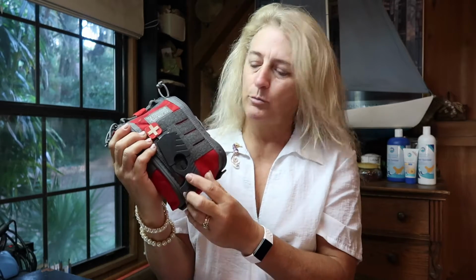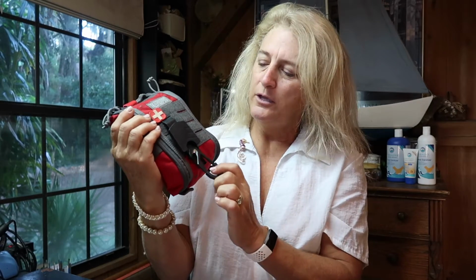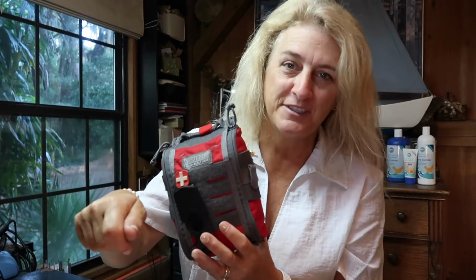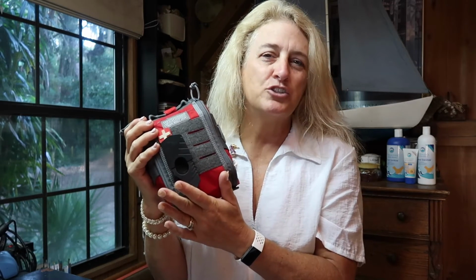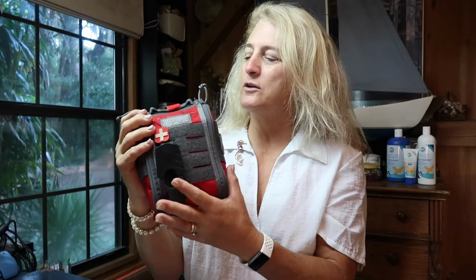On the outside I have a Gerber tool. This is something that my husband Bill picked out, and this is to strip away clothing. If you're on a boat and the boat is rocking around, maybe you're not as comfortable with having some sharp pointed scissors that you are trying to take someone's clothing off with to get to a wound. The other option would be a pair of medical shears that do have a blunt tip. This stays on the outside so that whoever grabs the bag first can start working on getting the clothing off.